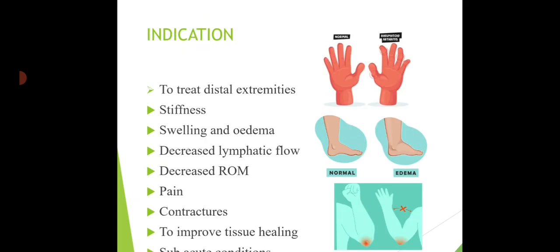Indications. Now let's talk about the indications of fluidotherapy. It can be used for stiffness, swelling, edema, decreased lymphatic flow, decreased range of motion, pain, contractures, and also to improve tissue healing. Here are a few examples. This is the normal foot and this is the foot with edema.